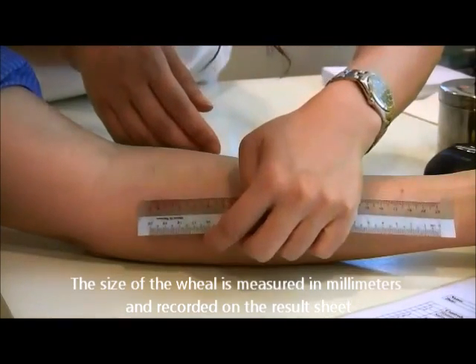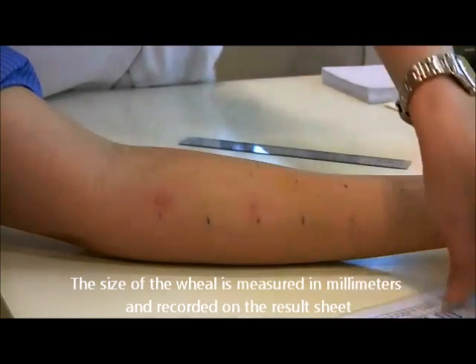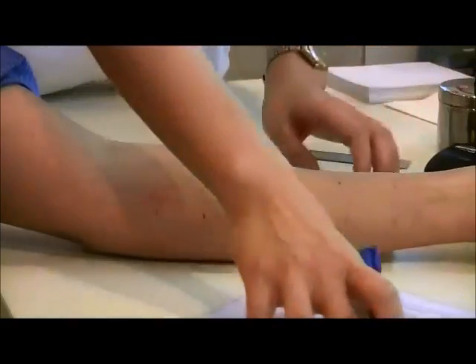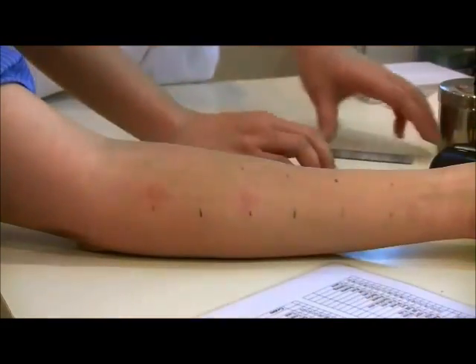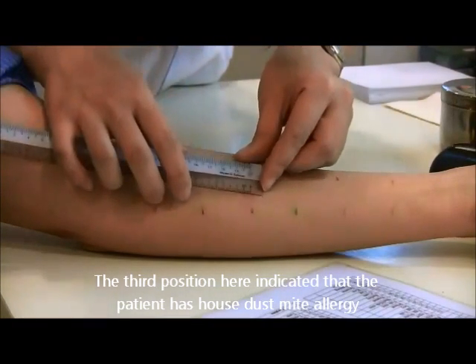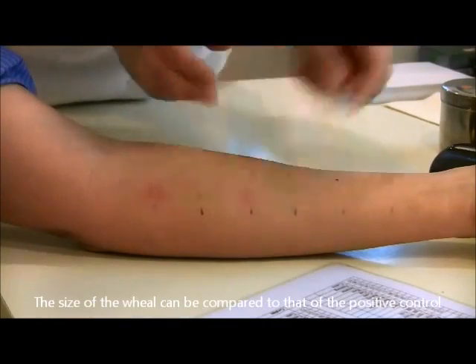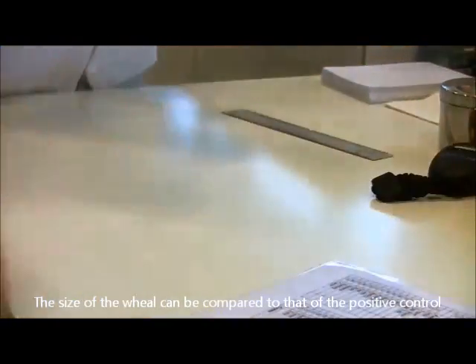The size of the wheal is measured in millimeters and recorded on the result sheet. The third position indicates that the patient has a house dust mite allergy. The size of the wheal can be compared to that of the positive control.